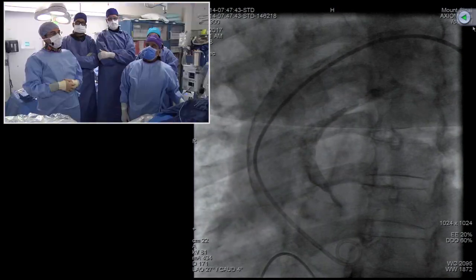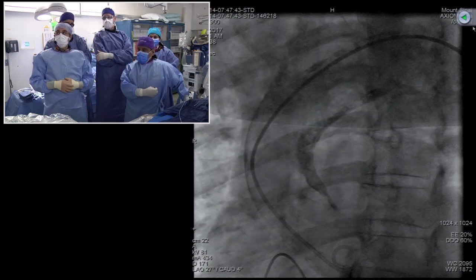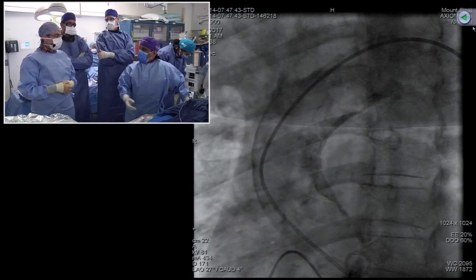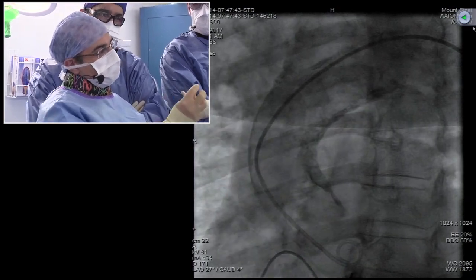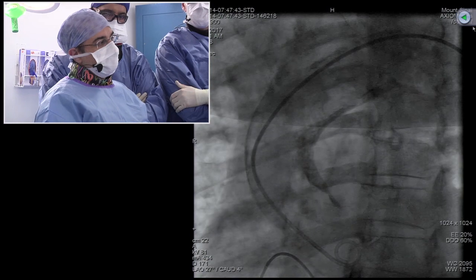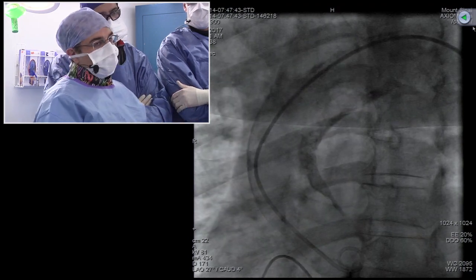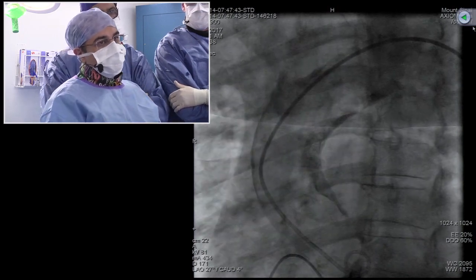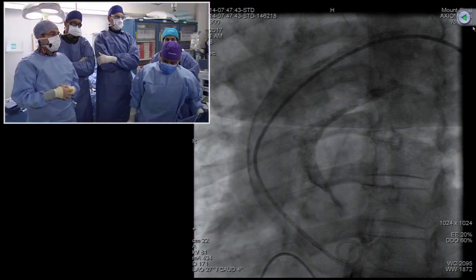Yeah, clearly, we used to do some balloon valvuloplasties for these cases. And I remember 6-7 years ago, one of the similar kind of patients, where we could not cross-clamp, some special graft. Another alternative would be to do an apical aortic conduit. That means you put a conduit at the apex of the left ventricle, and then in the middle of the tube, you have a bioprosthetic valve, and the other end of the tube is grafted to the descending aorta. That was done in a limited group of very high-risk patients, or patients with porcelain aorta. But now that we have this alternative of TAVR, I don't think there are many indications for an apical aortic conduit. Yeah, we have not done that in the last 6-7 years.